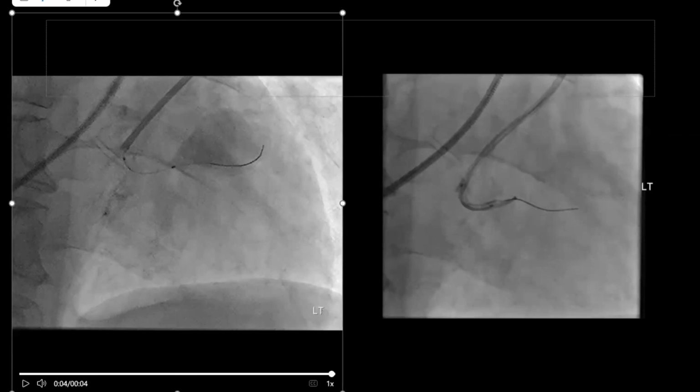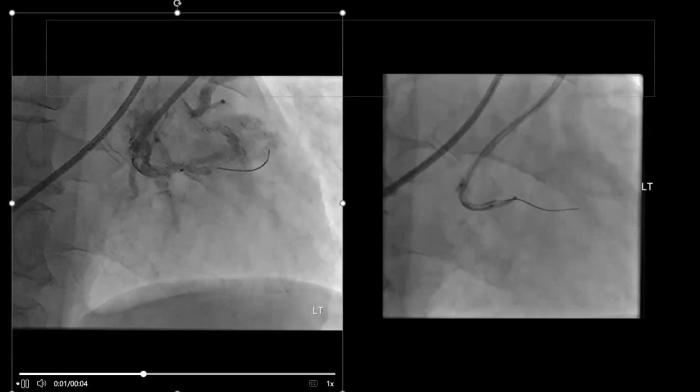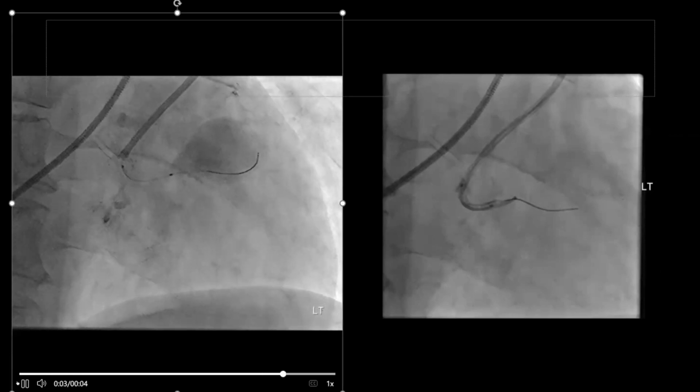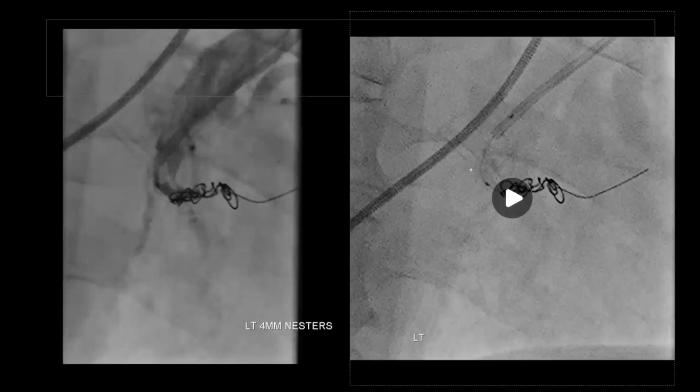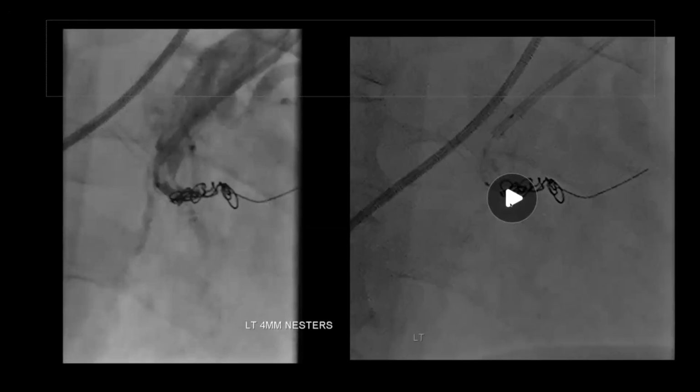And so thankfully, the way we do this is we use a guide cath, a 7 French guide cath. And so through that, you can put in a microcatheter quickly. We reinflate the balloon to block off the hole, and then we shoot in some Nester coils. So, and then can we go to the next slide?